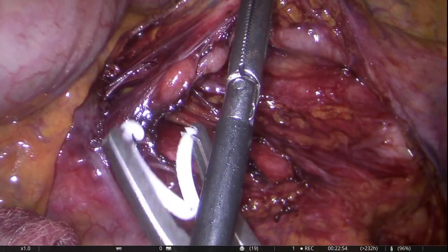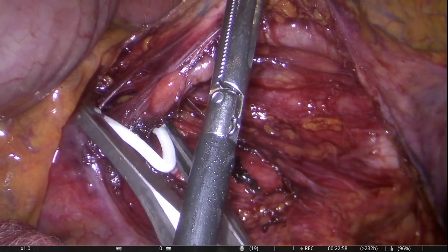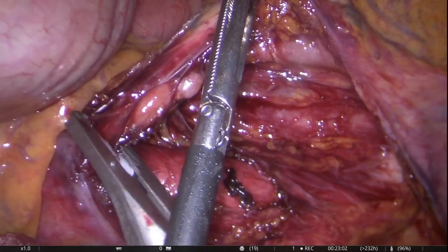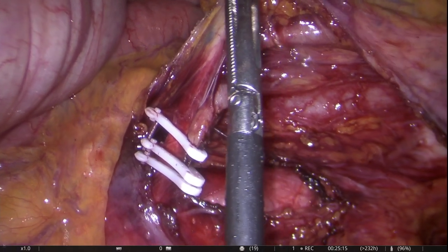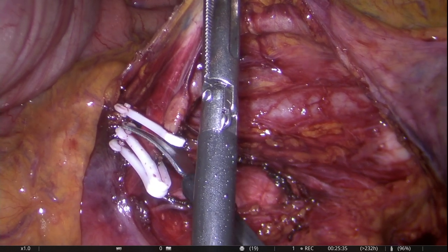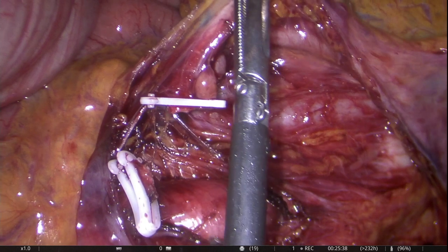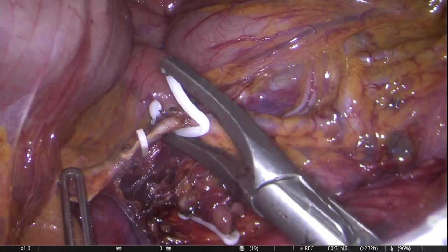Once satisfactory clearance is achieved, clips are being applied to achieve a high tie. As clearly demonstrated here, the IMA is taken straight off its origin from the aorta.